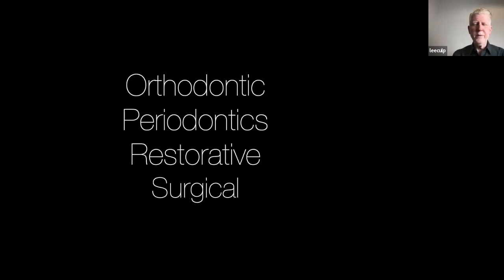And it was interesting, I was going to post this one. I just had a periodontist send me a CT and an IOS to make him a guide to show him how much bone he would need to reduce to get the tooth contours that he wanted. Once I got it on the screen, I'm looking at it and measuring, and I called him up and said, honestly, you don't need to do any bone work. Here's your tissue thickness, here's your bone. This is all soft tissue work.